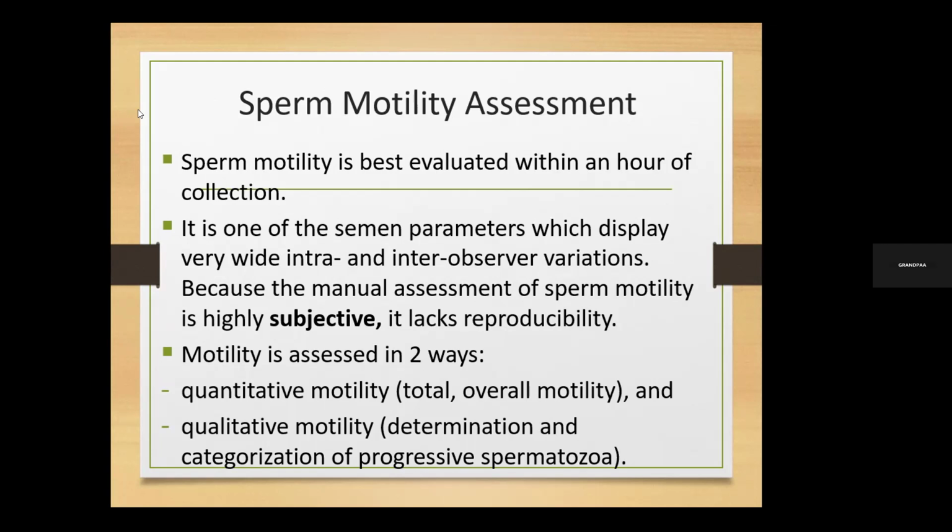It gives you an indication because you are seeing the wave to think that, okay, because the wave is strong, then you also have high motility. But that is not used to assess motility. So motility is now going to be assessed based on what you are seeing the sperm cells do, seeing them move, and then trying to categorize it.